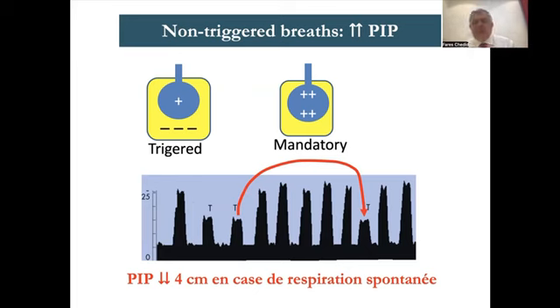So what I suggest you do: put a high level of triggering, so that the patient is unable to trigger, and then start decreasing the sensitivity of the trigger bit by bit. You decrease the button till the patient starts to trigger. You don't allow resistance to trigger; you allow very high sensitivity. You just keep decreasing the trigger sensitivity until, at the end, the patient starts triggering. Then you say, this is the level at which I will put the patient, because this way I know he will trigger the breath and he will have less PIP.